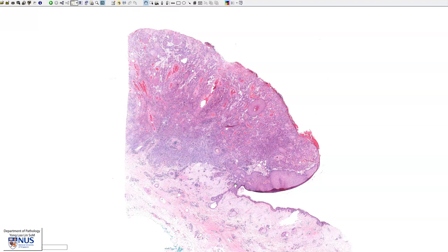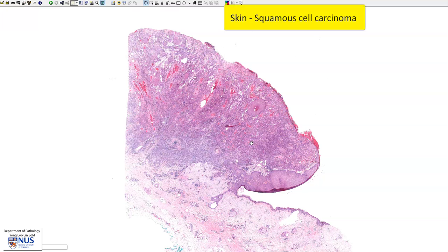Hello, this is a virtual microscopy slide of a case of squamous cell carcinoma of the skin. Here is the tumor, and this is the normal skin.